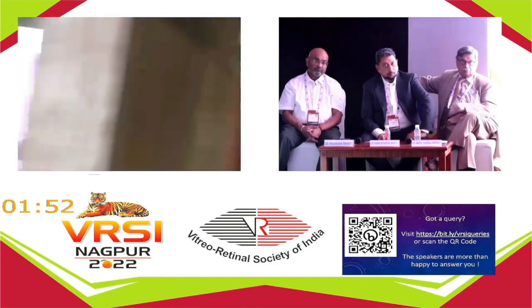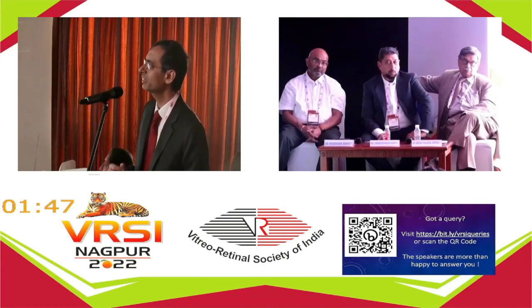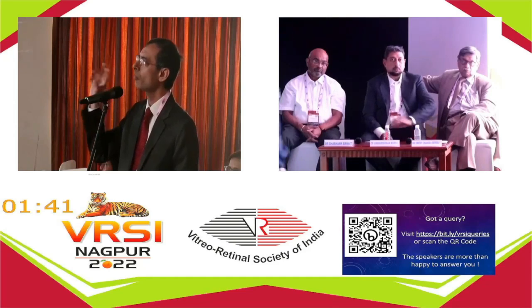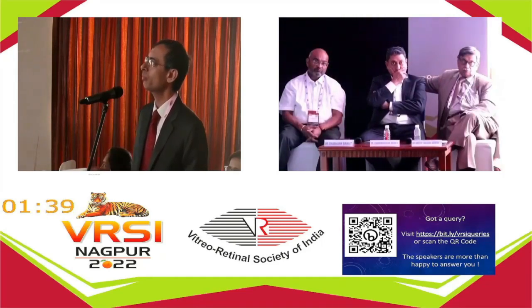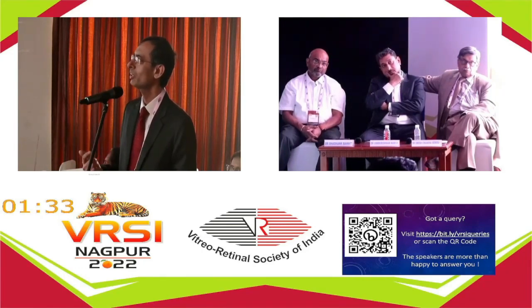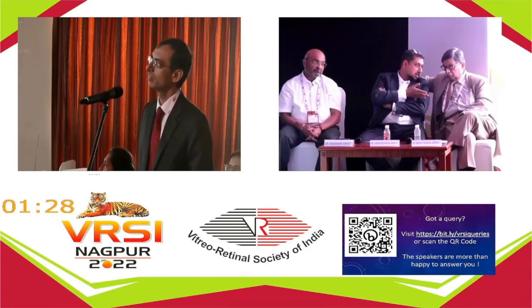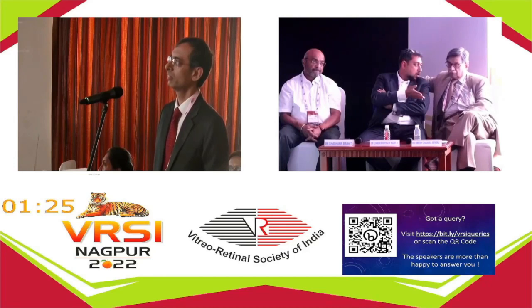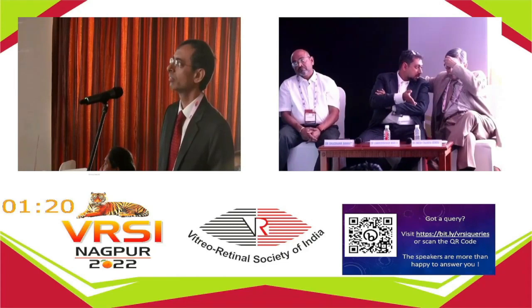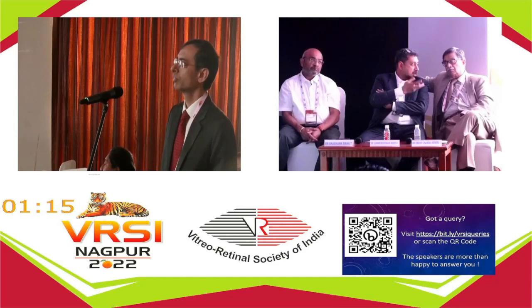Very nice paper, Dr. Charu. Just an observation, that temporal wedge is a very nice observation, but in my practice, generally, I do an ultra-wide field angiography in CRVO patients when I'm planning to maybe augment with some laser. So I want to identify the capillary non-perfusion areas. And many times I find them all over, not just in the temporal area. But from your images, it seems that they're mostly focused there. I don't know. Whether it is because you're separating the superficial and the deep, that's why we've got it. That's one of the feelings that I got, that it has become more evident because we've separated the plexuses. Even we never noticed it in the pre-OCT era, but now we seem to see it much more.